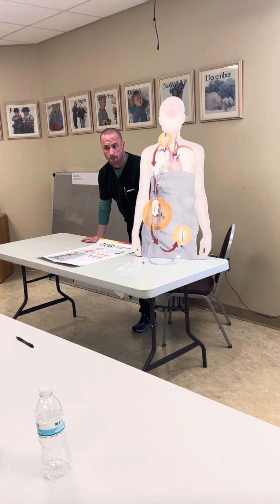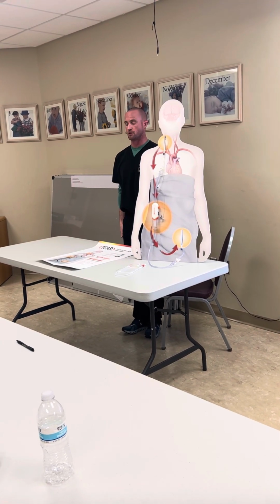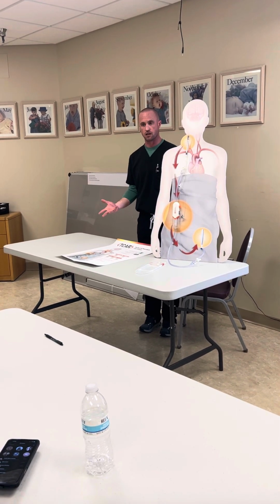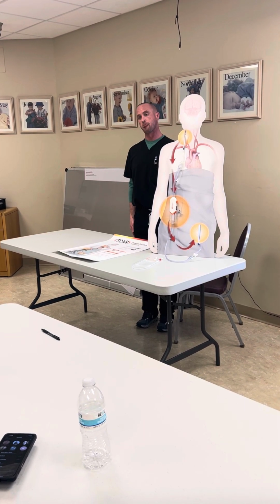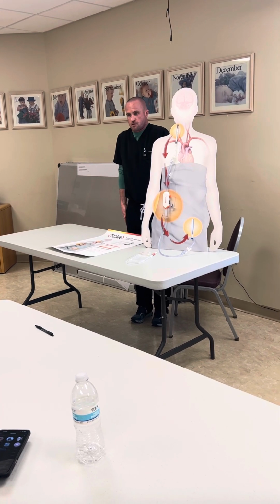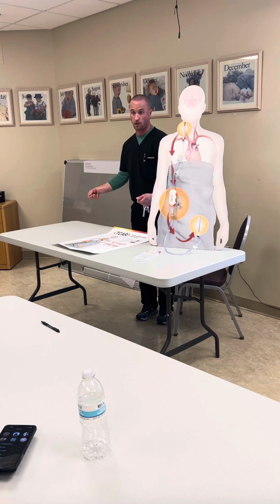Arms tucked back, like a shoulder roll. And Dr. Reiser's pretty good with that. His first assist used to help out with that. We'll get Dr. Reiser involved, make sure he's positioning right, but you're just wanting to extend as much as you can. Yeah, so it helps. Shoulder roll and like a little shoulder head roll, make sure arms are down, pulling down if you need to, because sometimes they're shrugged. It's simple, again, we usually just roll up a blanket.